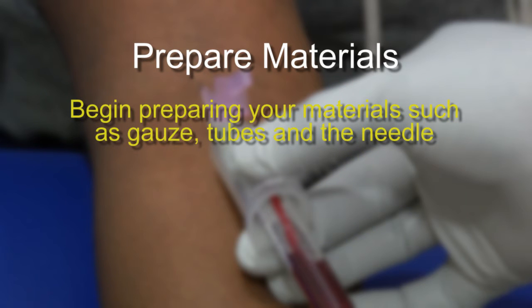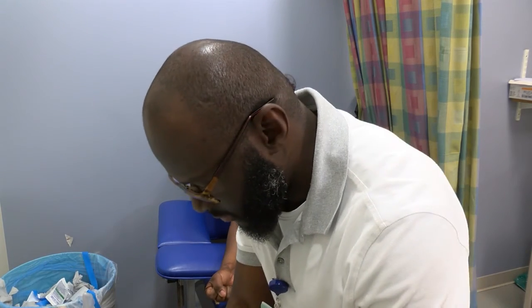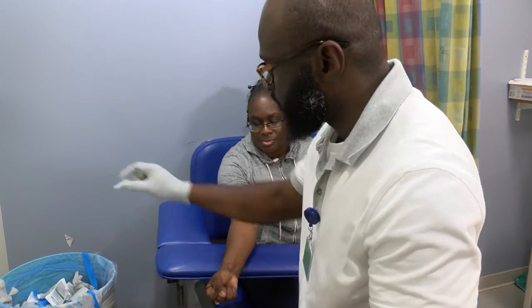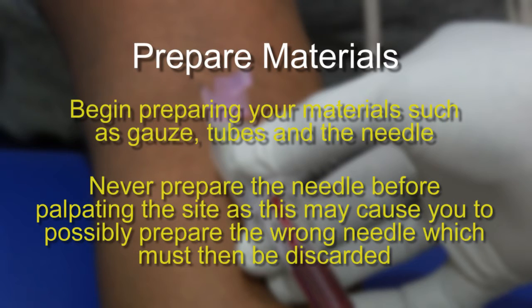Prepare materials. Begin preparing your material, such as the gauze, tubes, and needle. I'm going to get my tubes ready. In addition, you should never prepare your needle prior to palpating the site, as this can cause you to possibly prepare the wrong gauge needle, which can no longer be used and must be discarded.